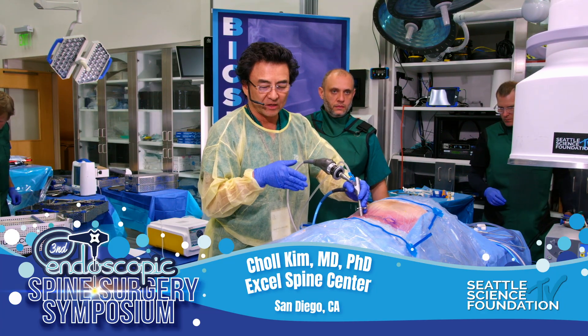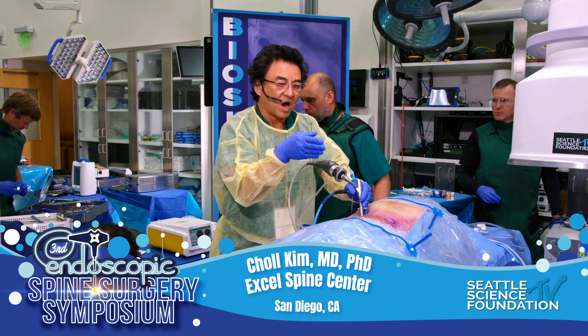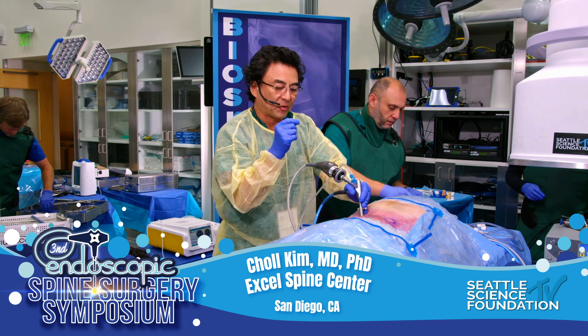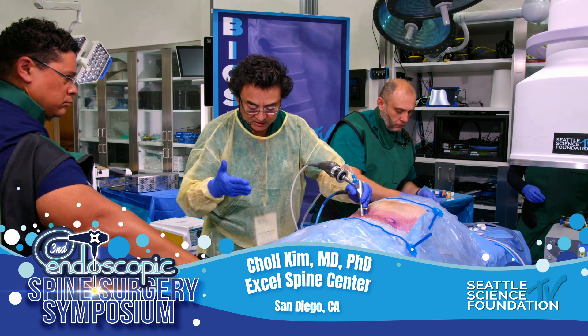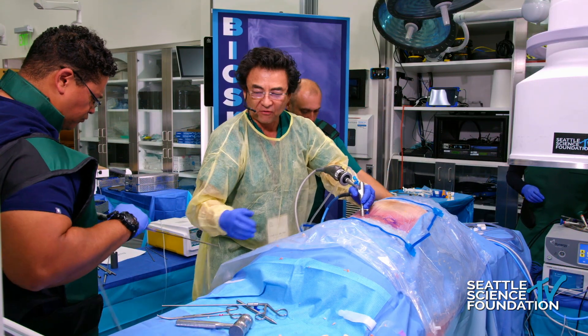The simplest principle is that it's a metal rod that basically vibrates back and forth very fast, and through that vibration, when it touches something rigid, it will break it down — kind of like a cast saw but at super high frequency — and there's an element of heat involved.